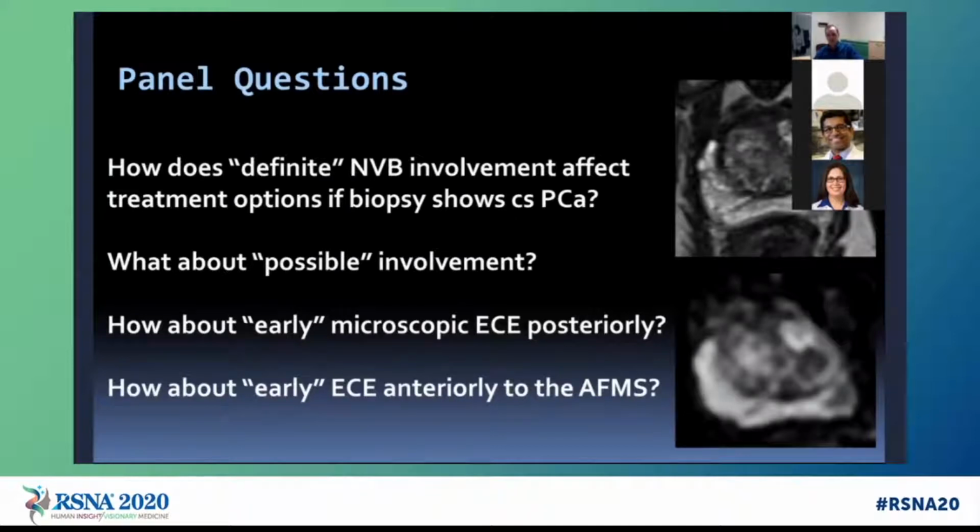I think generally these are pretty straightforward. Although I'm just starting to get more and more comfortable with them and more experience with them, because it's not something that we've used for many years yet, I have definitely seen cases where it's possible, unfortunately, for the gel to infiltrate in areas where it's not supposed to go. And when you see that, you definitely see that. So I think it's fairly straightforward.